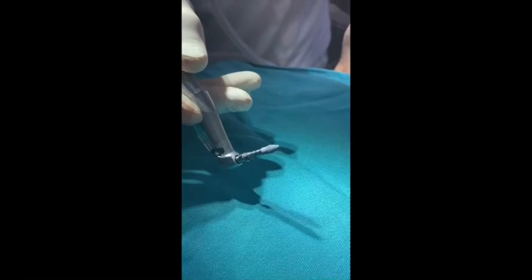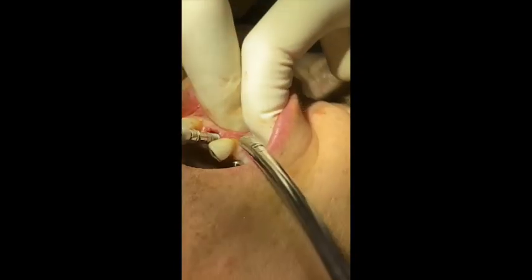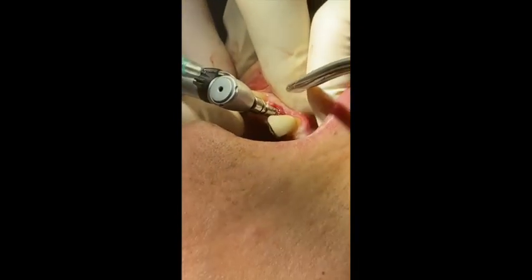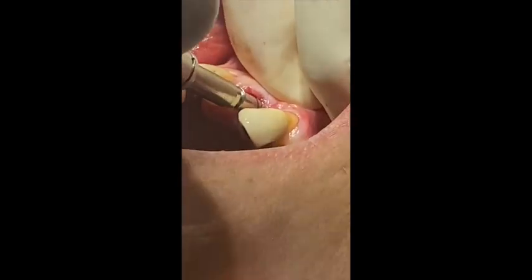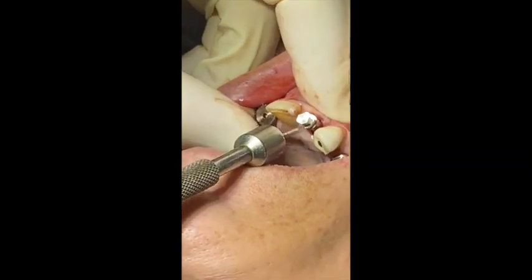12 degrees — 5mm is becoming a 4mm. Aim for the incisal edge here. There you go. With 12 degrees it will come into the right place. Very nice stability. Let's tighten it so that the fixture mount doesn't come loose.